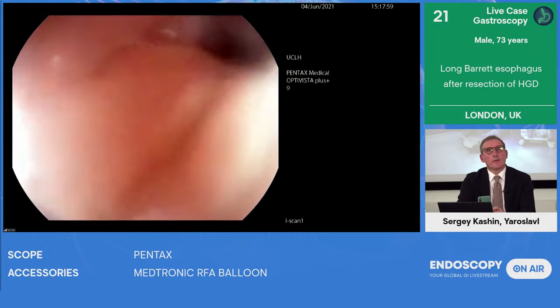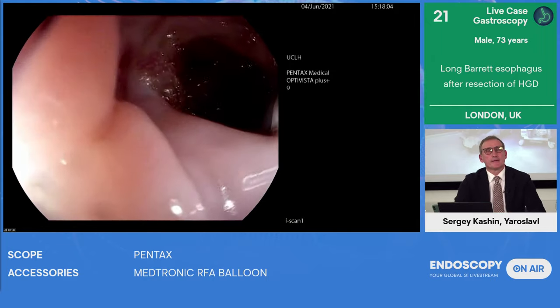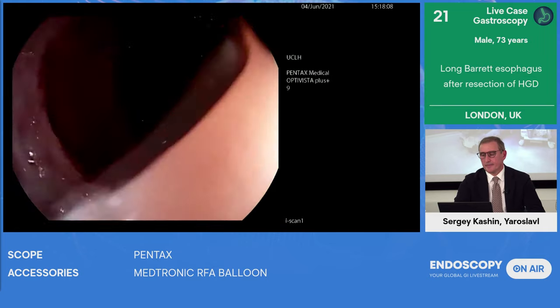Rehan, you have very one minute. Enough. Yep. No. Oh, yeah. There we go. So you can see the balloon expanded. It's very tight here, so it slipped down a bit. So we're just going to have to do this blindly slightly.